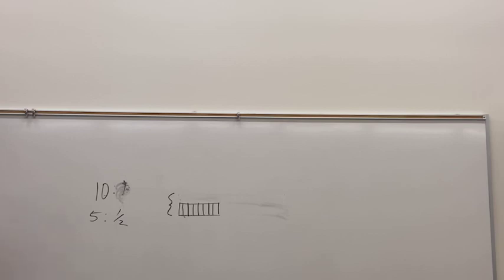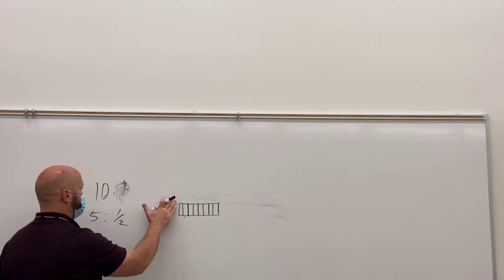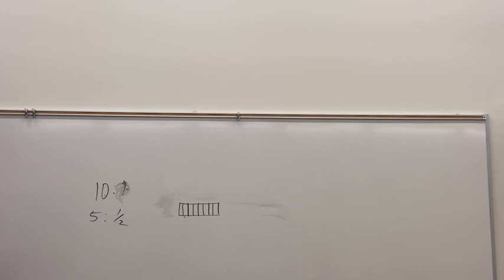Now, this is just incidental, not really much of anything, but where do you put your markers? Generally speaking, when you're doing a KUB, where do you put your marker? On the table, on the patient, or in the bucky itself most of the time? In the bucky. I put it in the bucky. In the bucky? Okay, good.